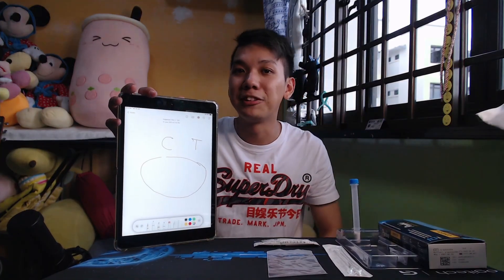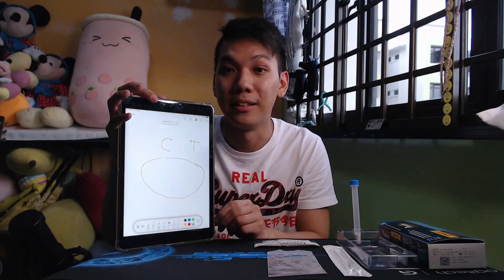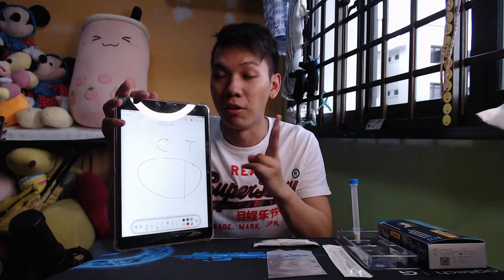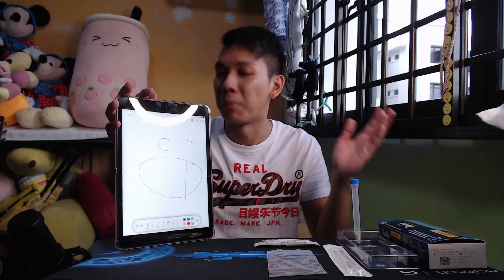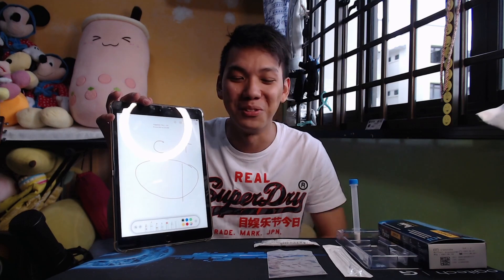What if after 15 minutes you see nothing — no lines? Or you get a line at T but the line at C is blank? Either of these two cases means the test procedure was not done correctly and the test has failed — you need to try again. But it is a bit expensive to do it twice, so just do it properly, get it done in one go. After you're done, pack everything in the zip-lock bag and throw it away.